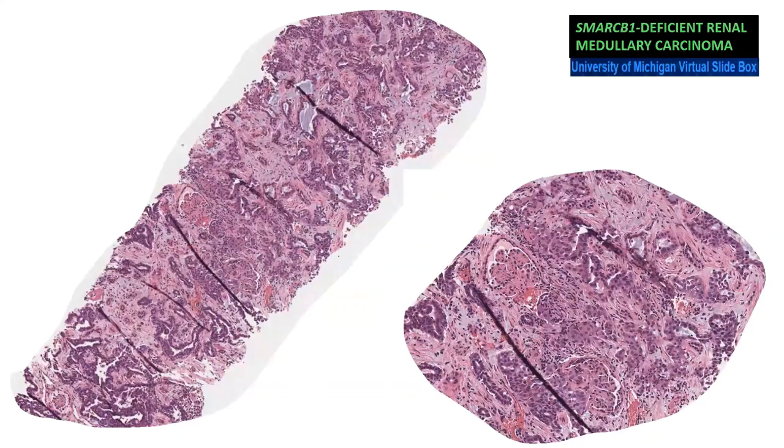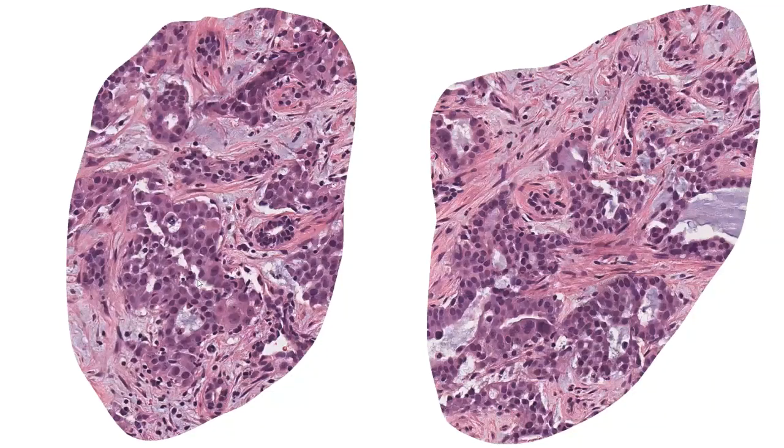Like, say, for example, in this virtual case, here you see there are infiltrating tubular elements which form cribriform nests as well as papillary clusters at places, and these appear to insinuate through the normal glomeruli which are seen in the background, infiltrating through the normal tubular and glomerular elements. These atypical glands are forming cribriform clusters at places.